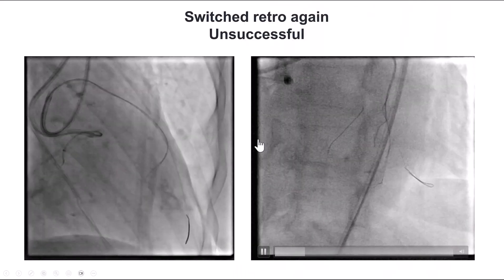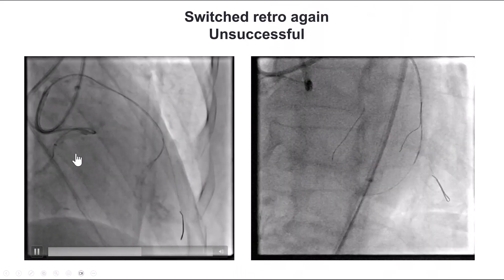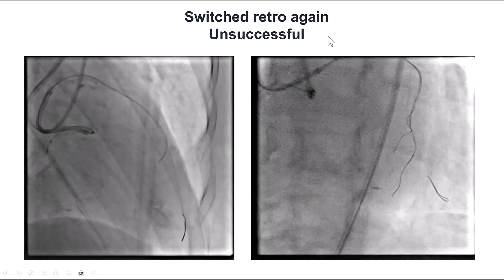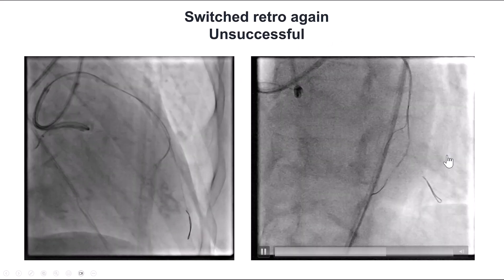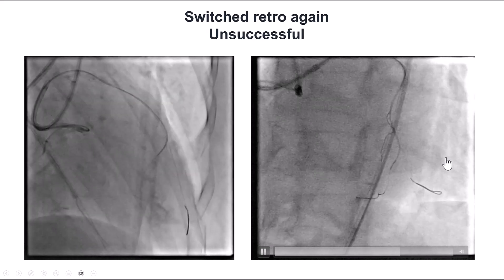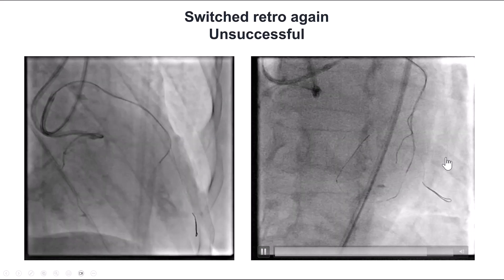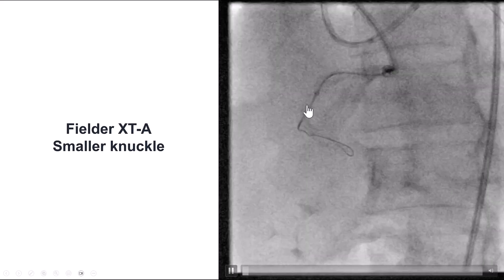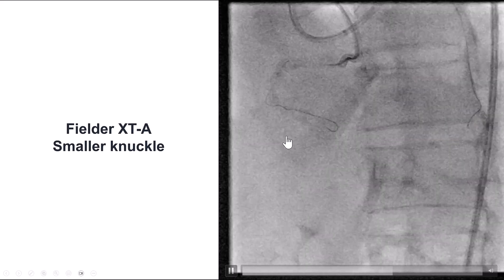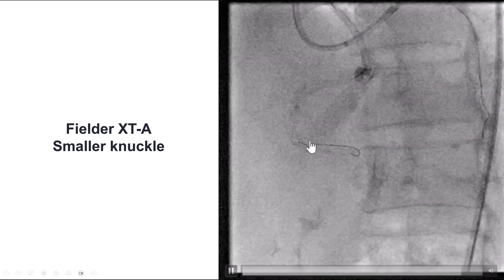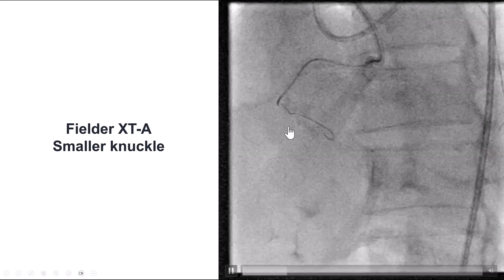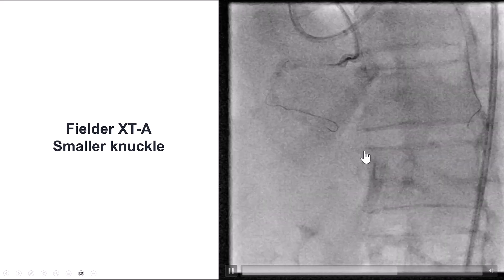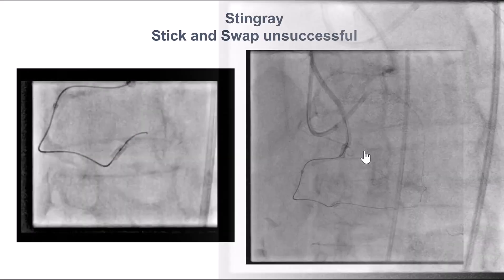After doing that, we still had difficulty delivering anything through the mid-RCA, so we tried retrograde again, but once again we were unsuccessful despite trying multiple collaterals. Back to antegrade, this time using the Fielder XTA, which seemed to create a smaller knuckle that advanced along the course of the calcium and the vessel.